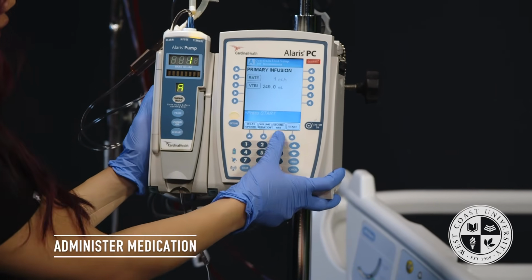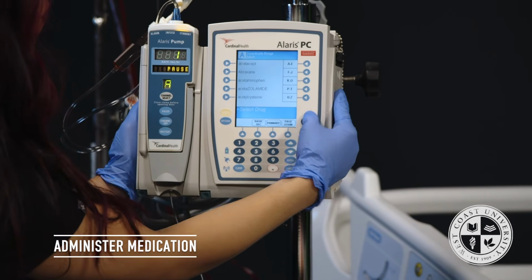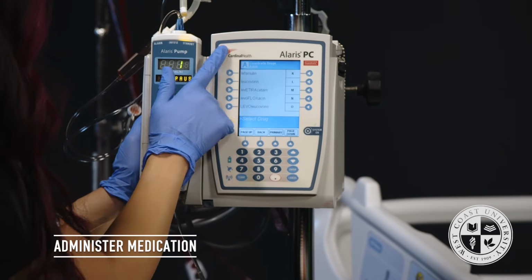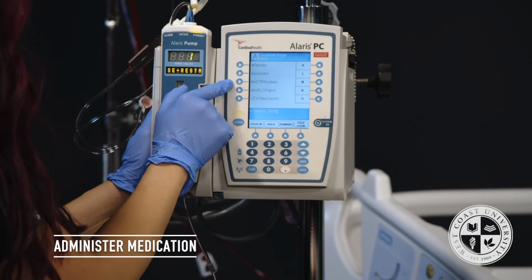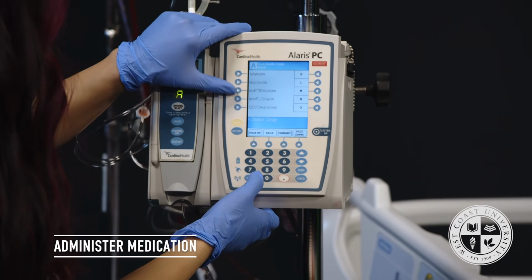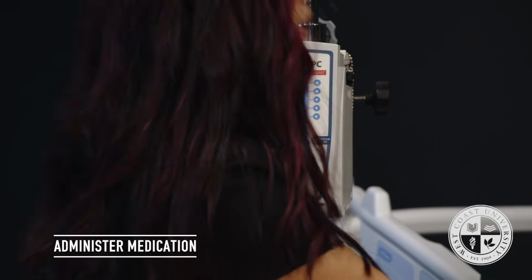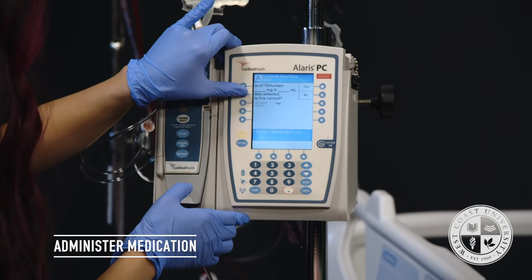So I'm going to push channel select and push secondary. I'm going to use my little alphabet guide right over here, in which it's going to be in that range. I'm going to push L, and I see that my pump is already in the page of the letter L medications. I know that the medication's name is also levetiracetam or Keppra, so I'm going to go ahead and choose that. It's going to be infusing at 500 milligrams according to my MAR, which matches my bag, and so I'm going to program it at the milligram dosing.